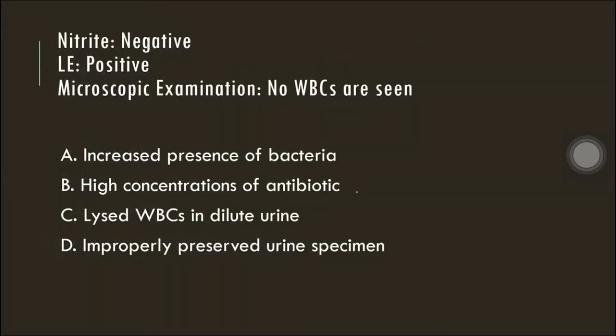Next, how about this question? Nitrite negative, LE positive, but for a microscopic examination, wala ulit nakitang WBCs. So again, yung sinabi ko kanina regarding the comparison of the leukocyte esterase and microscopic examination. Leukocyte esterase is considered as more sensitive than microscopic since it is able to detect the presence of WBCs by means of measuring esterase granules, kahit in cases of namaglize yung WBCs in dilute urine.